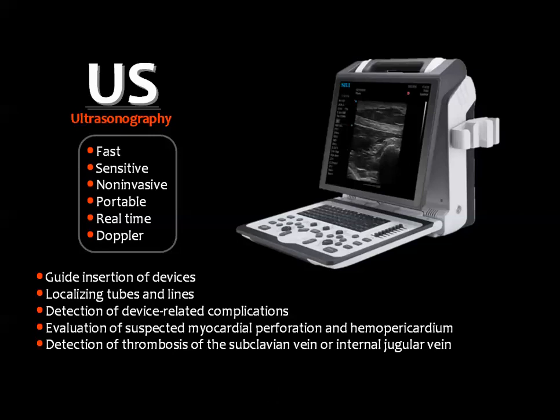Ultrasound is one of the best diagnostic modalities for the ICU patients because ultrasound has many advantages. It is a fast examination. It needs no preparation in most of the times. It is very sensitive. It is non-invasive. There is no radiation exposure. It is a portable machine.